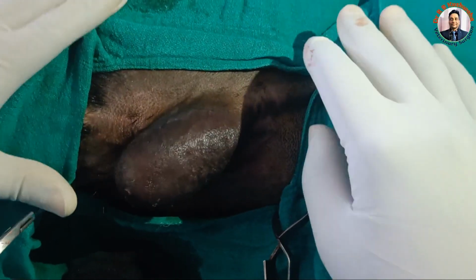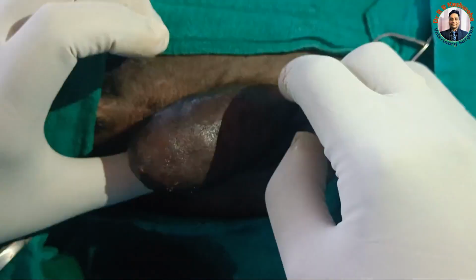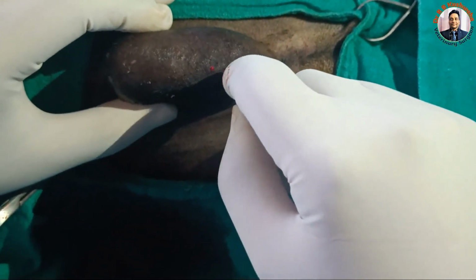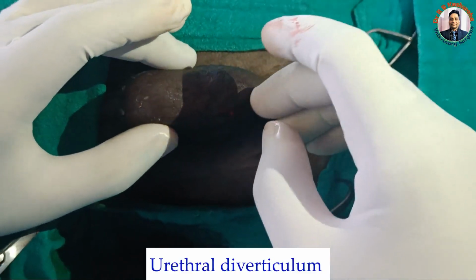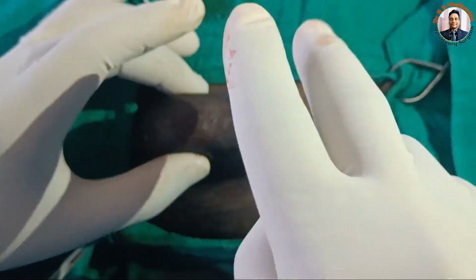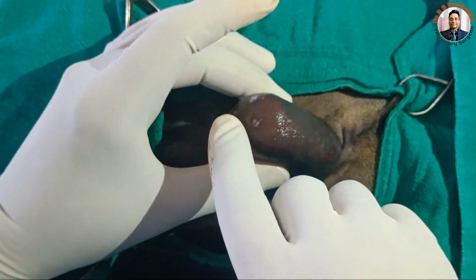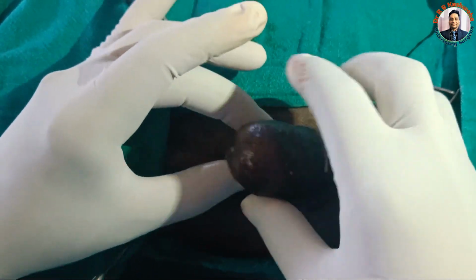We have prepared this mid-ventral area of the goat for aseptic surgery, and this swelling is because of the accumulation of urine. This accumulation of urine is most probably in the dilated urethra, or the urethra which is relaxed; in other words, this is because of the urethral diverticulum. In a few previous cases, urethral diverticulum was normally seen a little caudal to the prepuce, but here it extends from the tip of the prepuce up to almost 5 to 6 centimeters caudal.